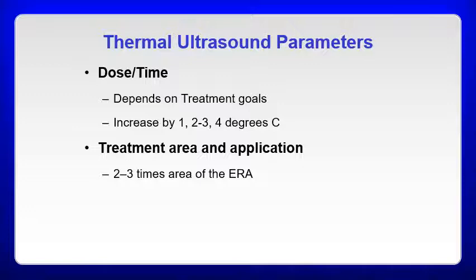Now, it's important that if you're going to do more than one treatment, particularly when you're looking to mobilize an area, that you respect the stretching window. We'll talk about the stretching window later, but if you increase the temperature to where you want to stretch and mobilize the tissue, you want to make sure that you do it pretty quick. The stretching window is about 5 minutes, meaning that after 5 minutes, you start to lose the effect of the ultrasound.